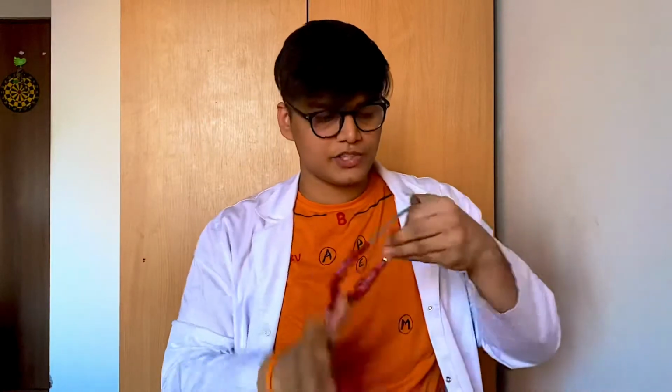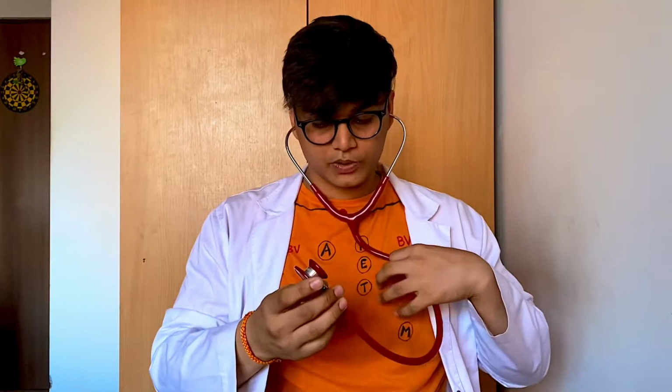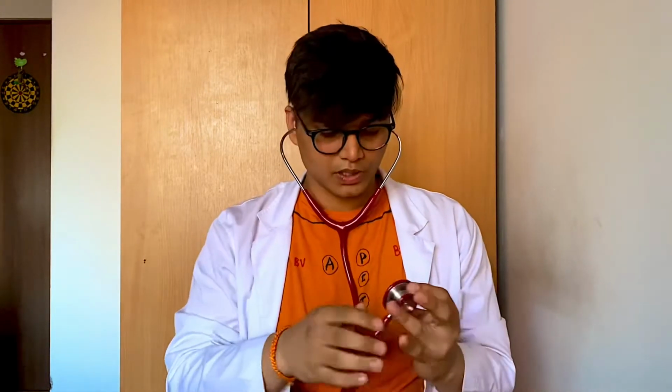For the S1 and S2 we use the diaphragm. For the S1 we use it on the mitral and the tricuspid auscultation points, and for the S2 we use it at the aortic and pulmonary. And to hear the murmurs you have to activate the bell. It's working. So you have to put the bell at the Erb's point to hear the murmurs of the heart. And to check if diaphragm is working, you have to just tap a little bit and you will hear it very loud. So here are all the sounds of all the auscultation points.